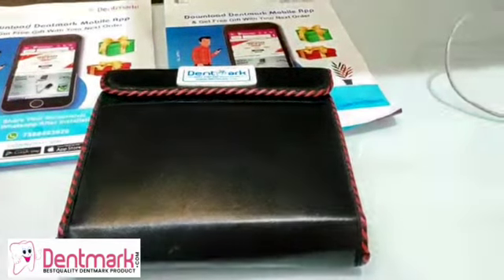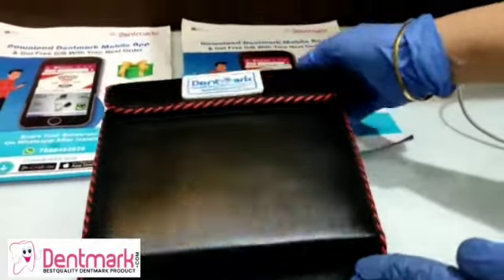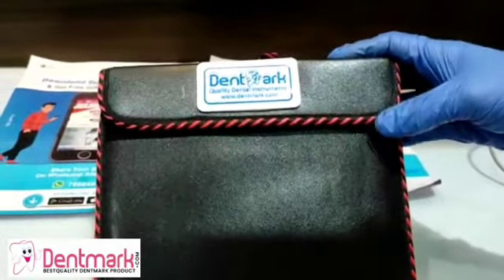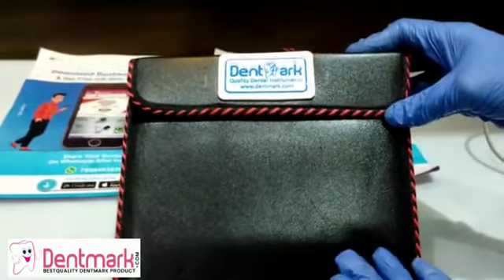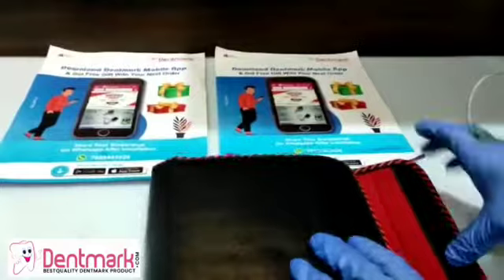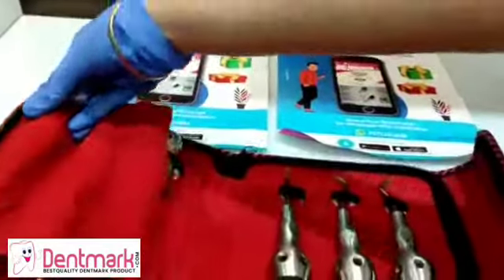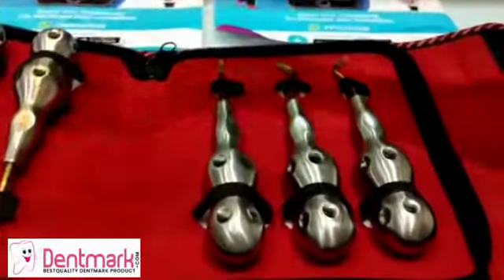Today we present another premium series: the Gold Series root elevator. It comes in a set of six pieces in a leather bag. Let's see these root elevators — the premium Gold Series. As you can see, these are the six pieces.